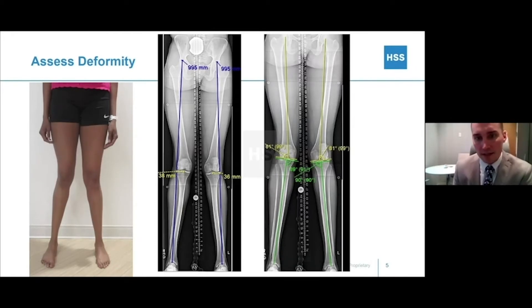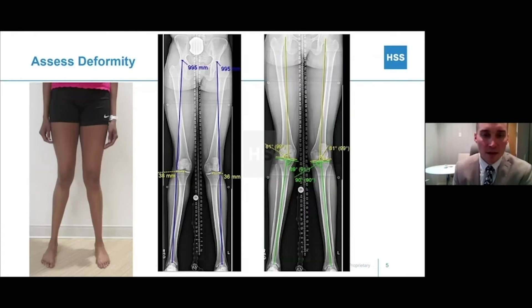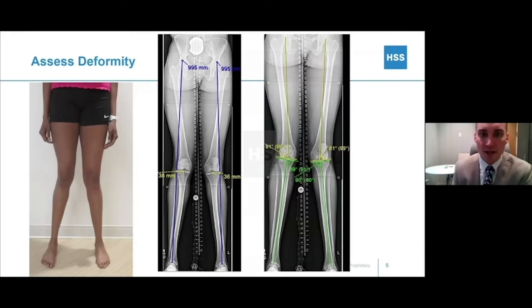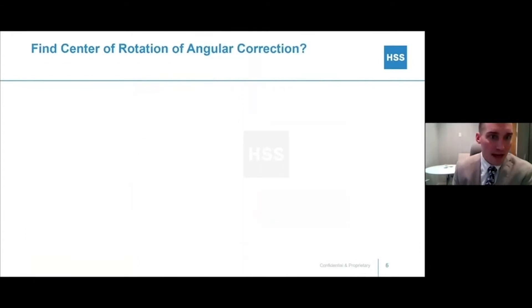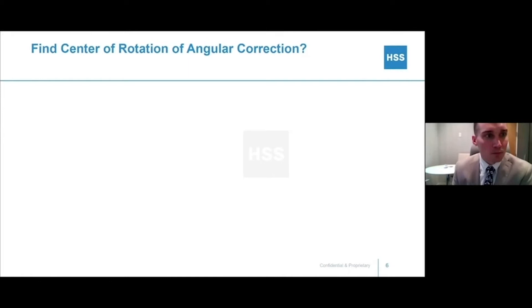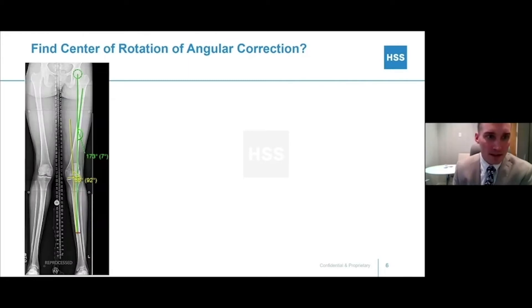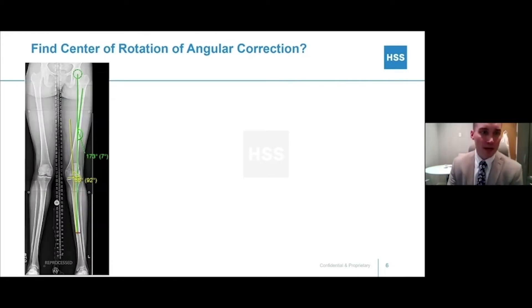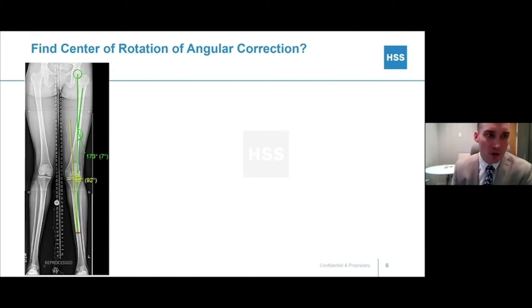In this case, 81 degrees is normal for the anatomic axis, but since we're measuring the mechanical axis here, that is too low and likely where the deformity is coming from, because her MPTAs in the tibia are relatively normal. If you were to look at a principles of deformities textbook like Paley's, you'd say you need to find the center of rotation of angular correction.